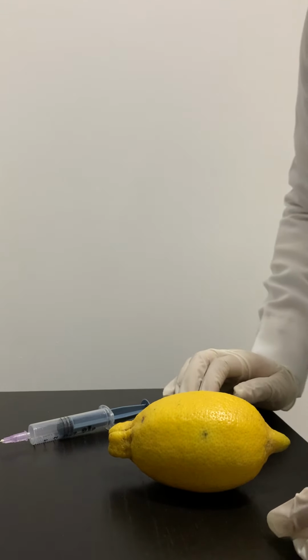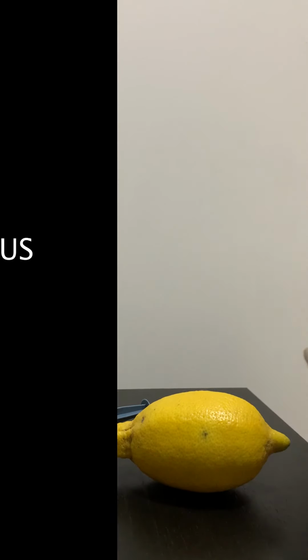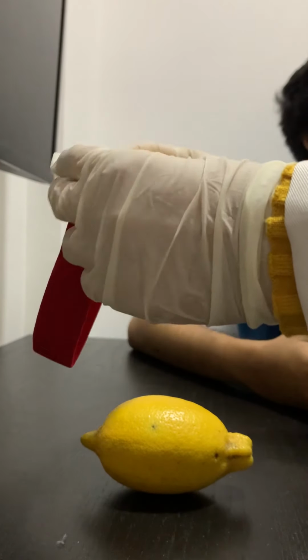Intramuscular injections are given for a quick absorption of delivery material. Next is intravenous injections. Intravenous injections are better than the other 2 injections because we can determine the exact concentration of medication in the blood. Before we begin the process, we must apply a tourniquet to find the position of the vein. So this is a simple way of applying a tourniquet. We can use a buckle tourniquet like this.